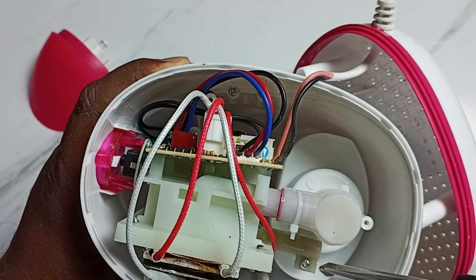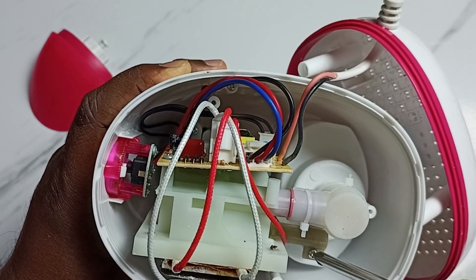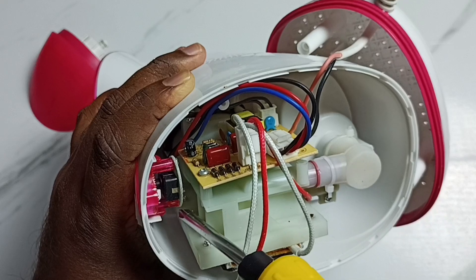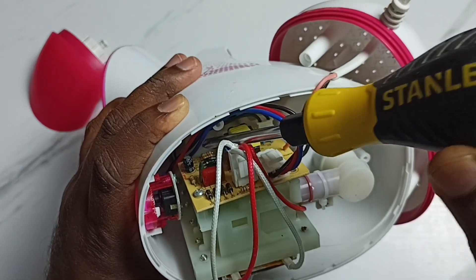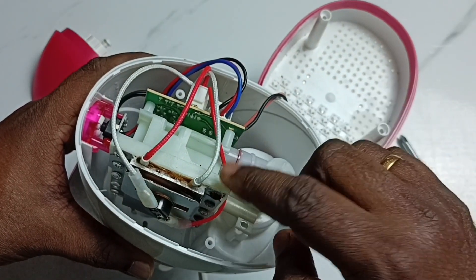We have to remove three more screws to take this mechanism outside. This is one screw, then here you can see another one, and the third one on this side. Let me remove them — done. Now let me take off this mechanism.